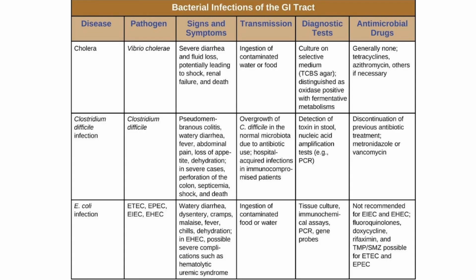And after that, this is the last slide, which mostly relates to bacterial infections of the GI tract. As we all know, if we want to diagnose infections relevant to the GI tract, then we must perform these types of methods. And the sample which is commonly used is the stool sample.